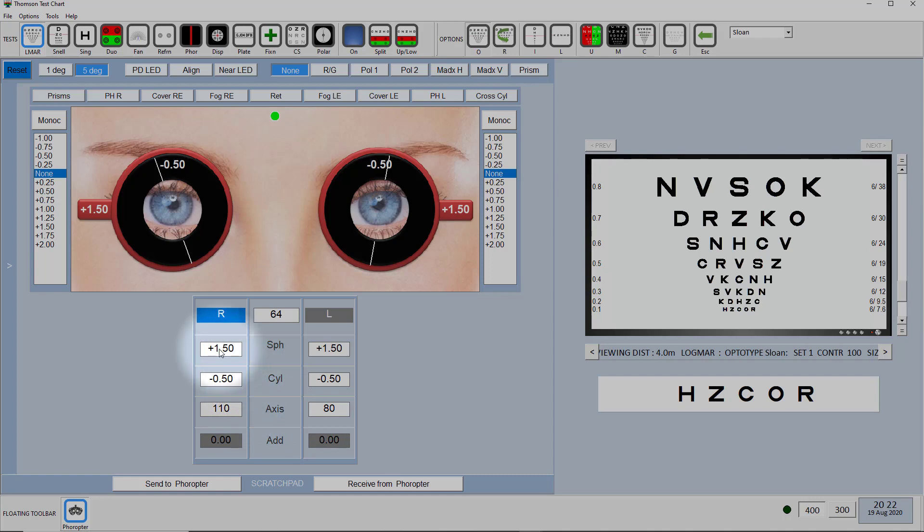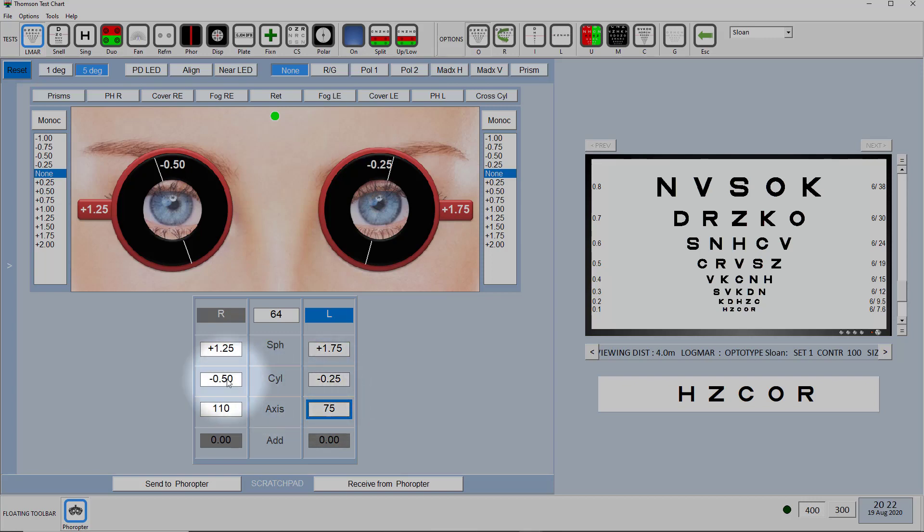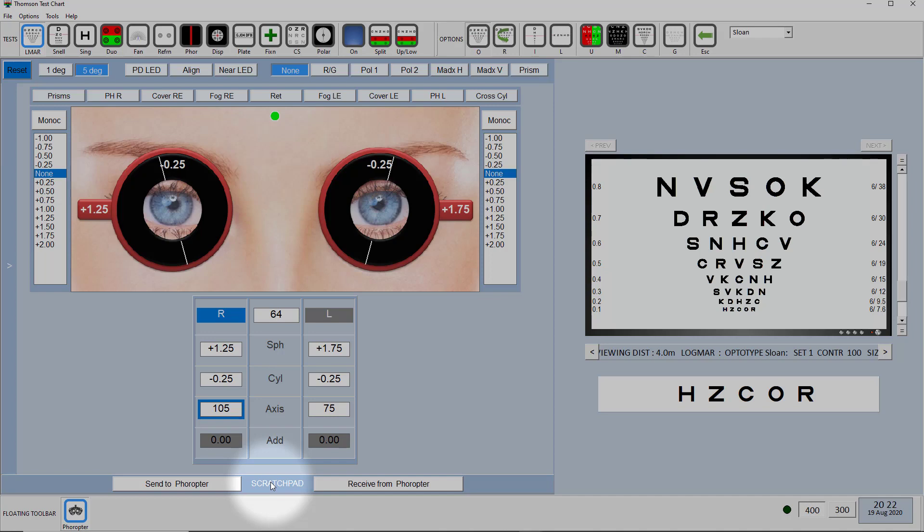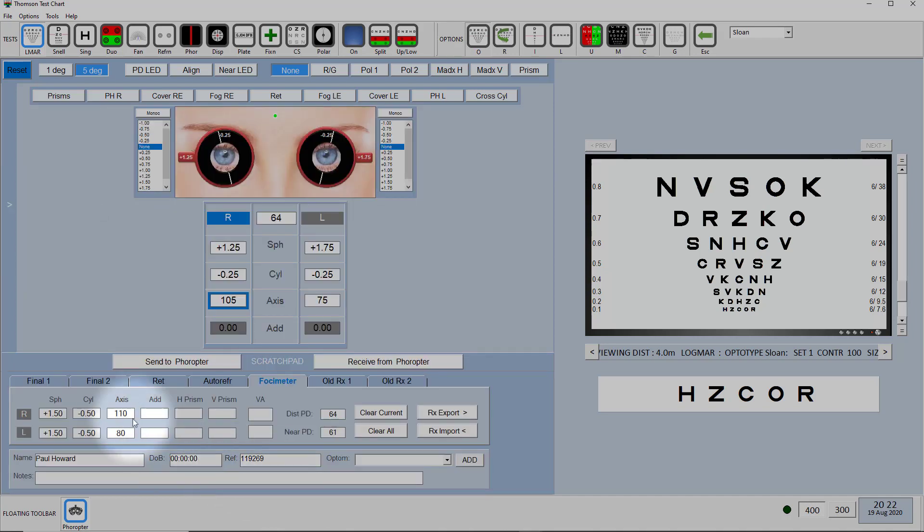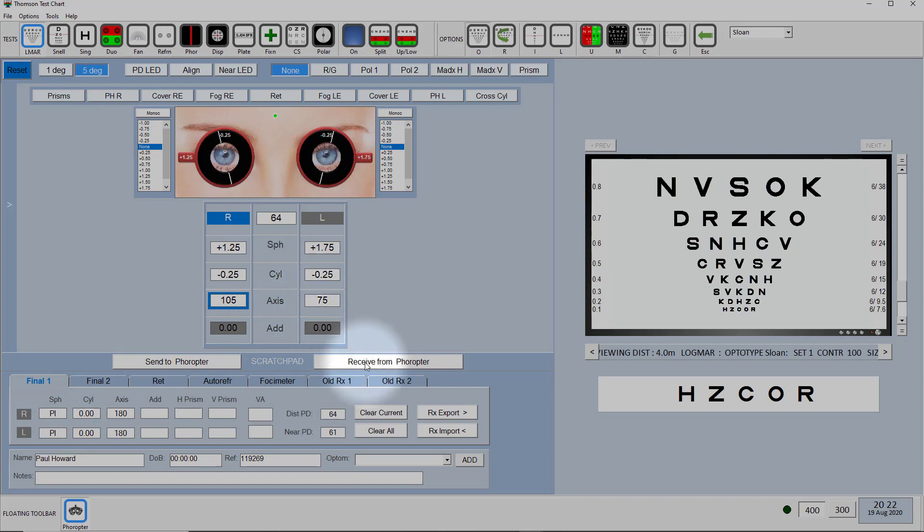You can then do your subjective so let's say that the new prescription might look something like that for sake of argument and now what we want to do is to put that final prescription back into the scratch pad so we click on scratch pad again and this time we select final and this time we want to receive this new prescription from the Phoropter into the scratch pad so I click on receive from Phoropter.